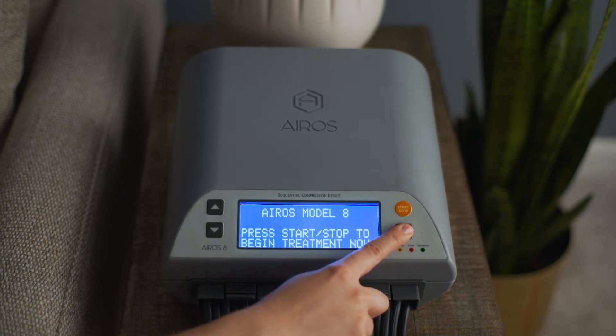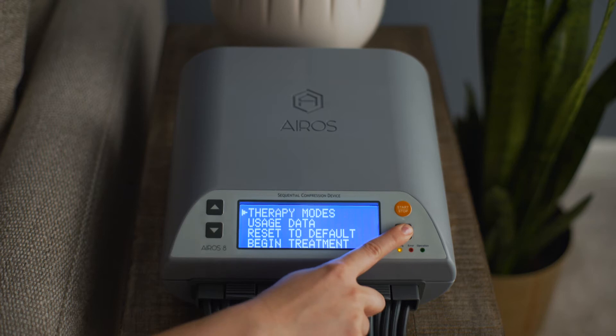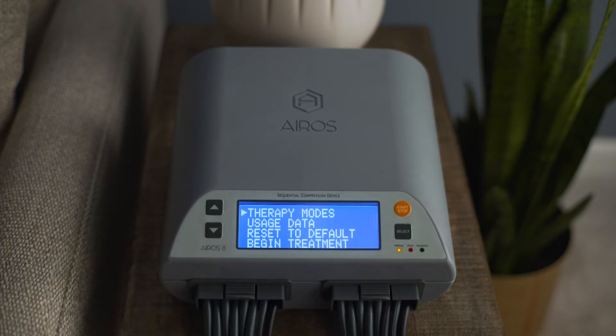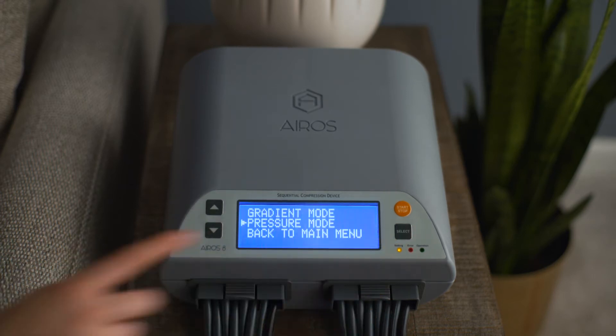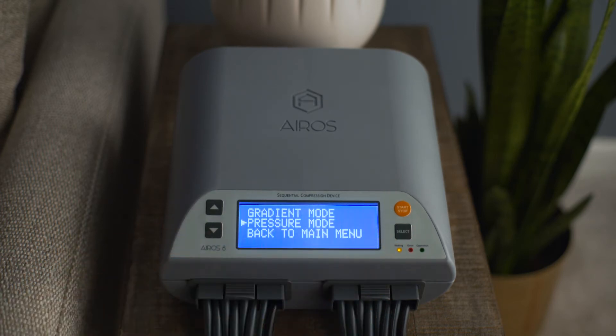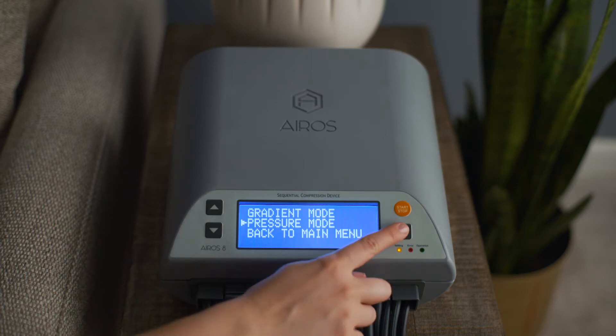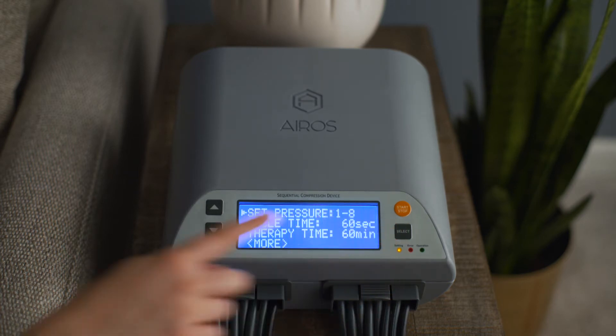From the main menu screen, scroll to Therapy Modes and press the Select button. Then scroll to Pressure Mode and press the Select button.